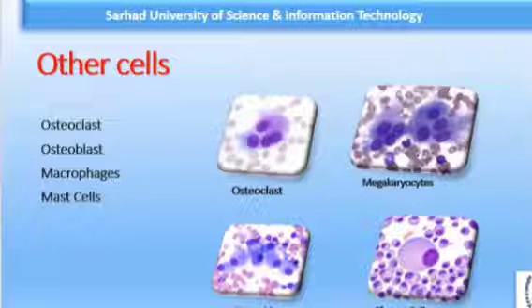At this stage, some normal and abnormal large cells may also be seen, like osteoblasts, macrophages, mast cells, and endothelial cells, and they are normally seen in small numbers, but their number may be increased in certain disease states. Osteoclasts should not be confused with the megakaryocytes.